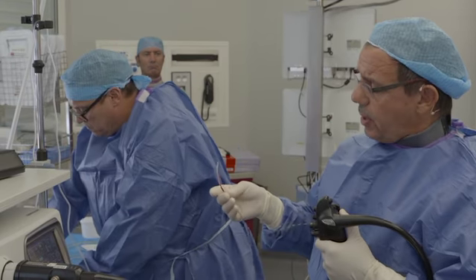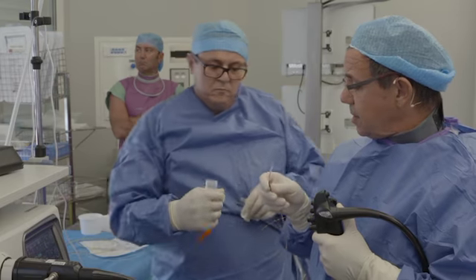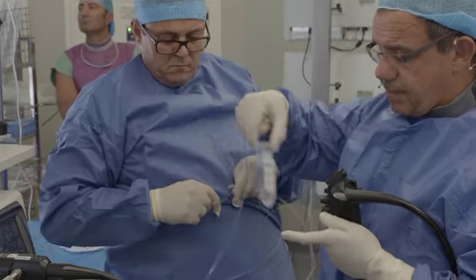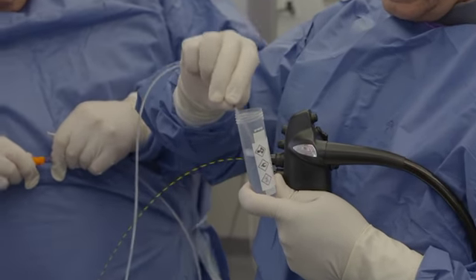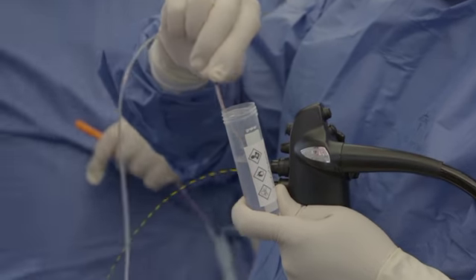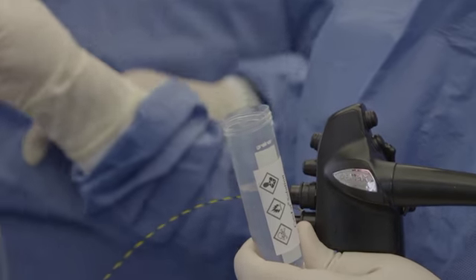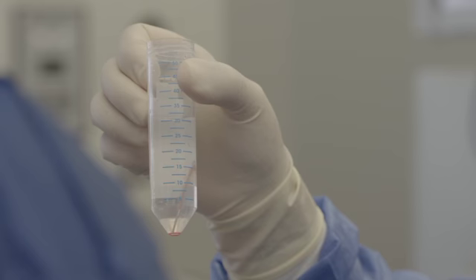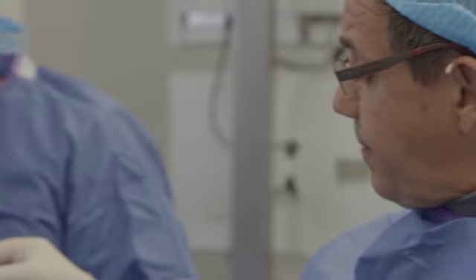Now we will put the brush into the cytolith. Now open the cytolith and open the brush. Push the brush out. Now it's very important to move a little bit, and after to cut. And the brush is inside the cytolith. And this is easy for the pathologist to have the cytology of the bile duct.